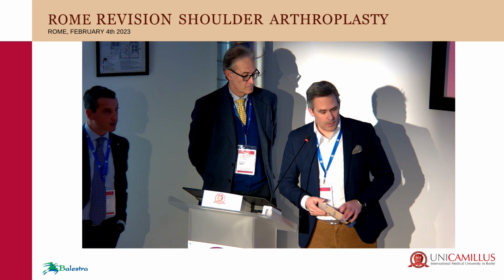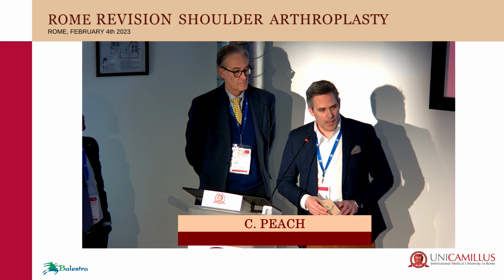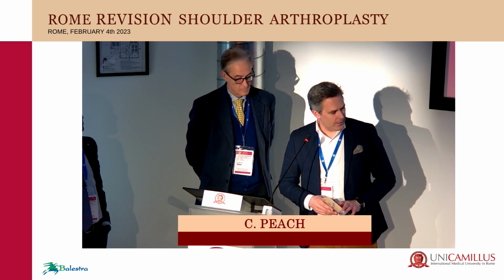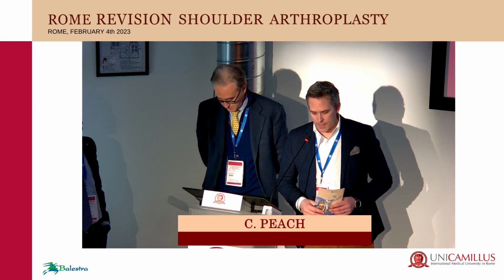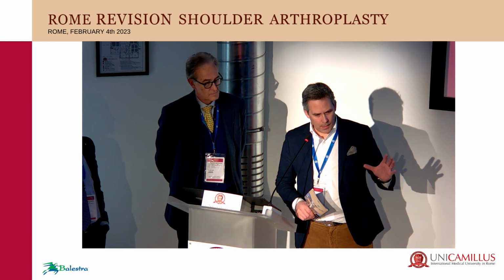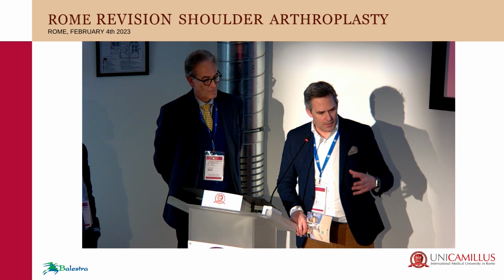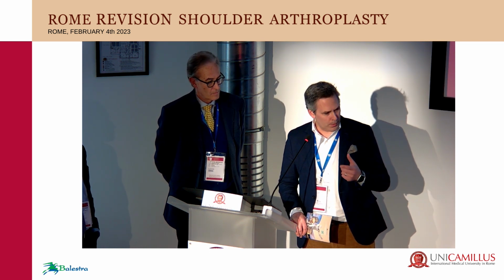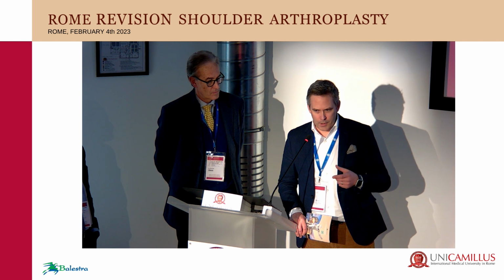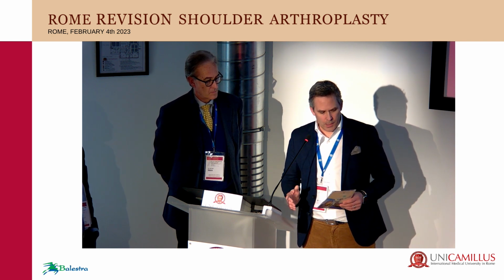Yeah, so I alluded to this, it's a really, really difficult thing to do. I think we're all doing our own things and probably think it works in our own hands. When I was training, I used the Delta prosthesis, and I was taught to put it in really tight. You pluck the coracobrachialis and want to hear a noise. With the Exactech prosthesis, I put it in a lot looser.